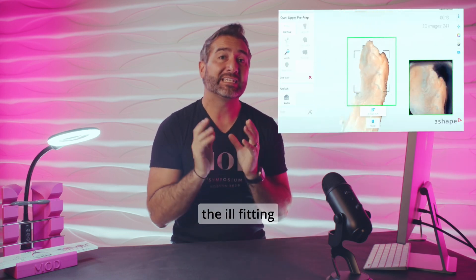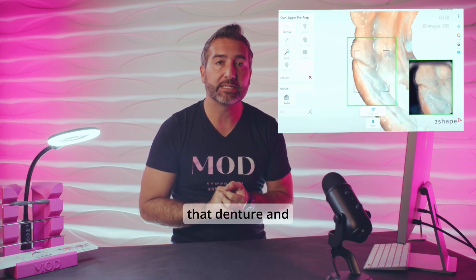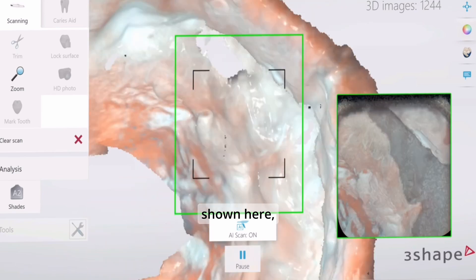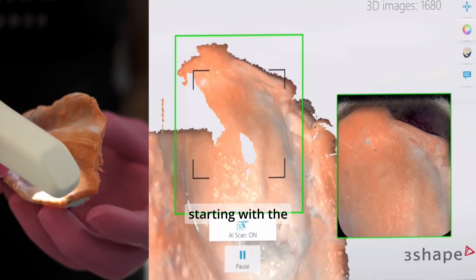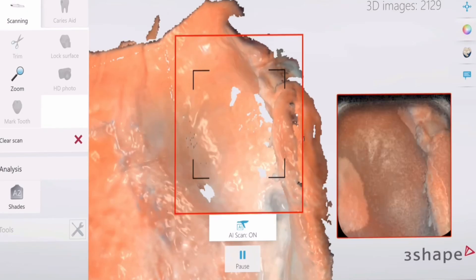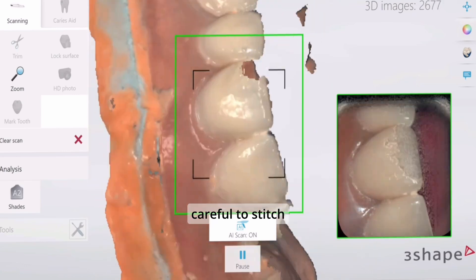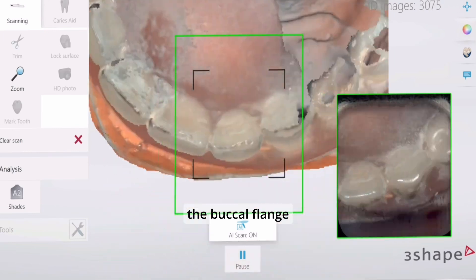The very first thing you're going to do with an ill-fitting denture is take a wash impression or a reline impression of that denture and then scan that into the software using your scanner. As shown here, you're going to be scanning the intaglio fitting surface of the denture first, starting with the hamular notch region and going all the way around to the contralateral hamular notch. Then you're going to capture your borders — it's super critical that you are very careful to stitch the intaglio of the denture to the buccal flange of the denture.